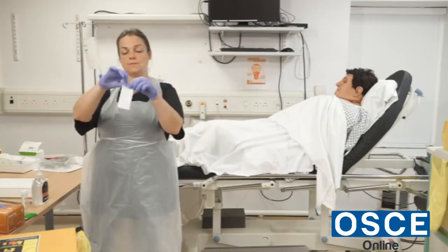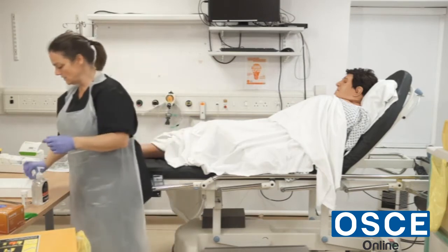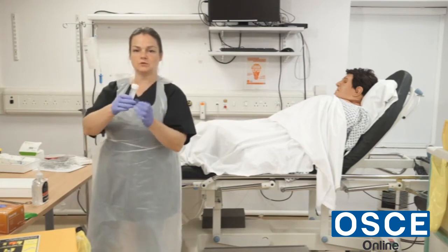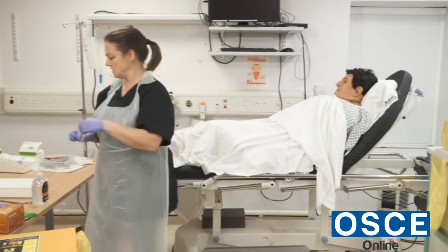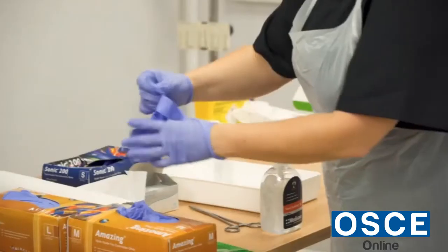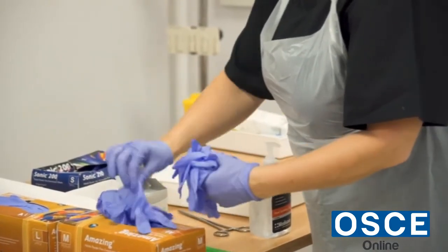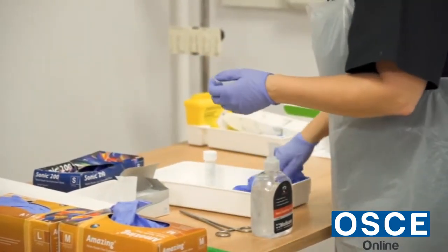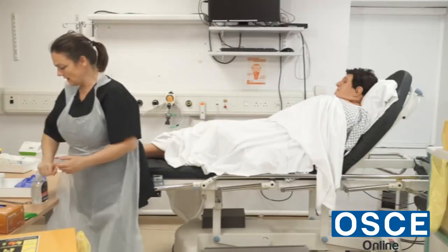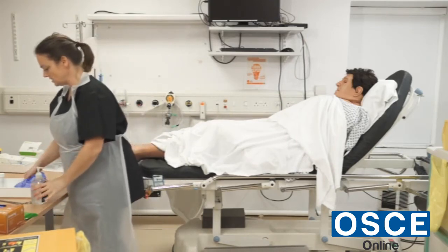I want to take two alcohol swabs, which are intact and in date till 9/22. I'll take the urine sample pot, which will be labeled correctly. I need to take three pairs of gloves — so six gloves total. I'll get rid of the extras, gel my hands, and go back to the patient.